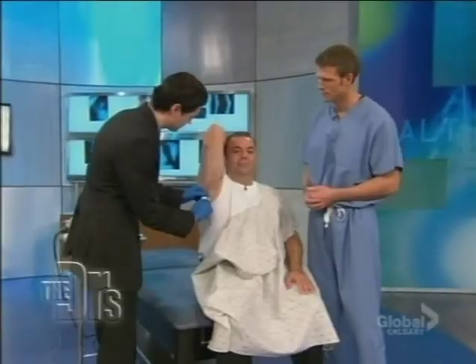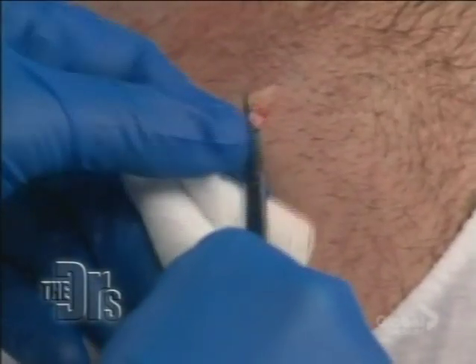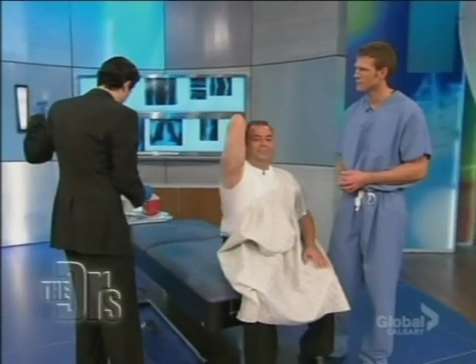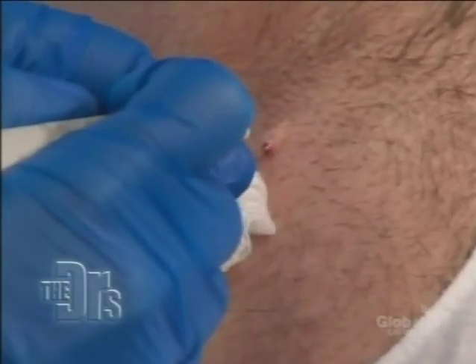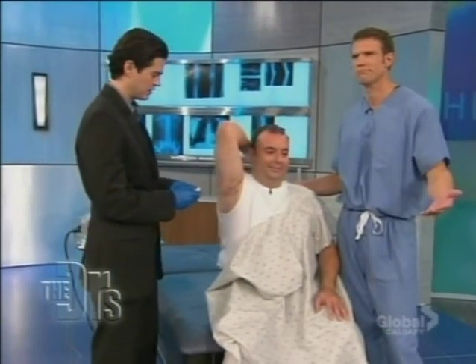These things can bleed. Now I'm going to do a little tiny snip here, Vito, on 3. We'll just do it on 3. 1, 2, 3, little tiny snip. Completely gone there. I'm going to cauterize the base with just a little bit of hyfrication here. So you might smell this and hear this, but you won't feel it. It wasn't bad. You weren't in pain, right? I didn't even feel anything. Beautiful. Little tiny burning here. So that'll destroy any residual tissue exactly at the base of the skin tag. And we're really done. It was that simple. We're going to put a little Band-Aid on it.